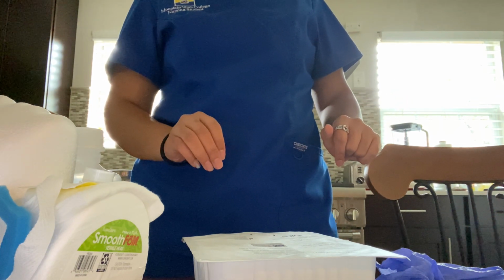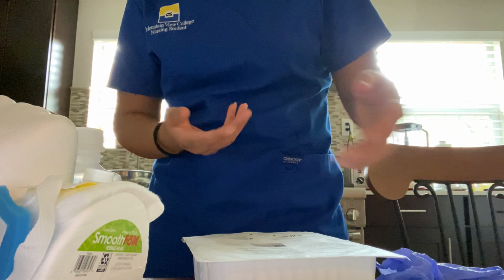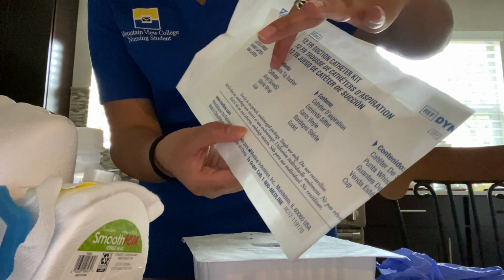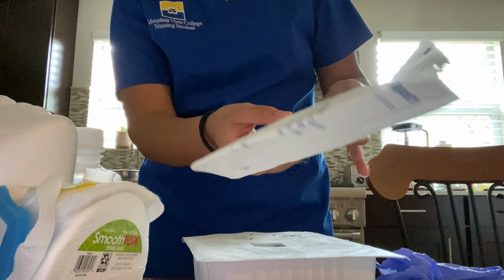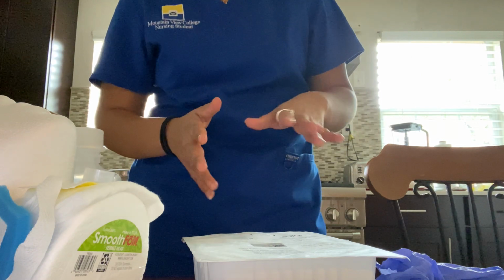We're going to make sure the sterile table is ready, and I'm going to verbalize opening the suctioning kit. I'm just going to tell you what is in it. It has a whistle tip suction catheter, vinyl gloves, a sterile wrap, and a cup. That cup, you're going to pop open before putting on the sterile gloves.